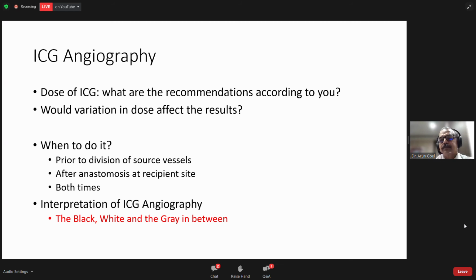You mean how we differentiate the venous and arterial? Yes, because this is a dynamic imaging. So we are holding the camera and we inject the dye. So we first see the dye inside the artery and crossing the anastomosis. So if there is no problem in the perfusion of the flap, there is no problem with the artery. And after that, a few seconds after, we see the venous. So this is one of the advantages of using the ICG, that is a dynamic imaging. So we can differentiate that easily.